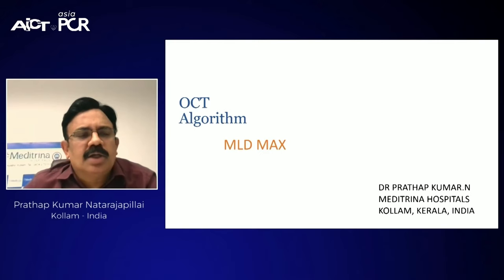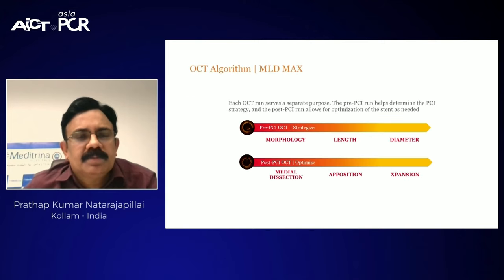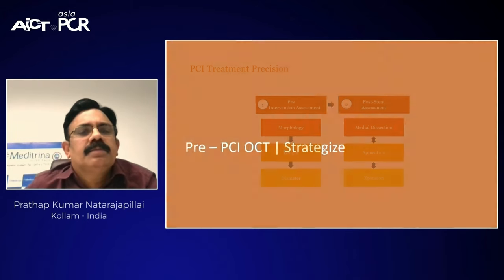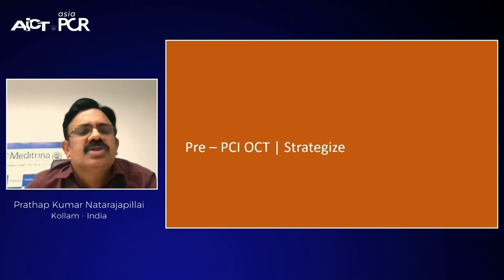Today we are talking about the OCT algorithm, MLD Max. We are talking about morphology, length and diameter in pre-PCI, and in post-PCI, dissection, apposition, and expansion. We are thinking about morphology, length and diameter in pre-PCI. So the pre-PCI strategies.